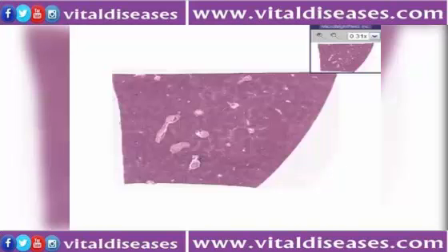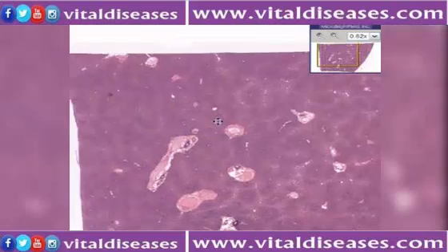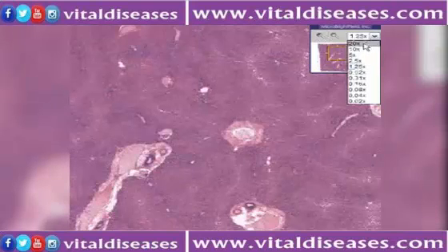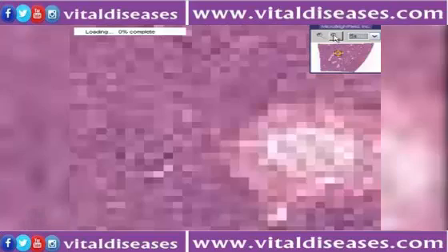Okay, boys and girls, this is a test to see if our virtual microscope works. So, let's see if we could blow up our piece of liver here. Here we go, blowing it up and moving it around and blowing it up to the max as a test, and then blowing it back down step by step.